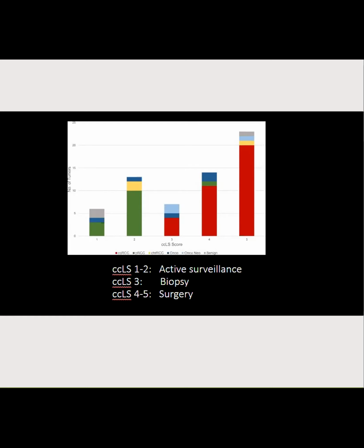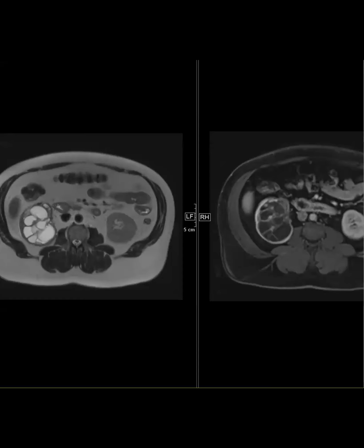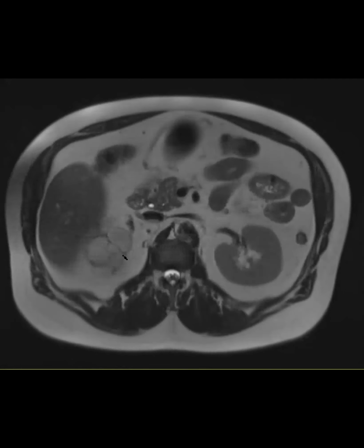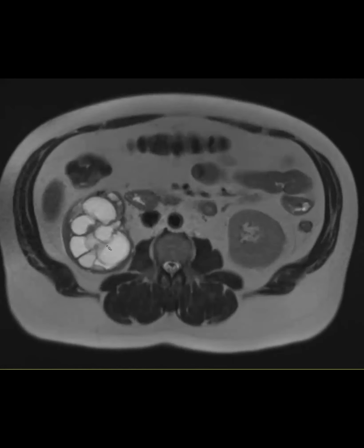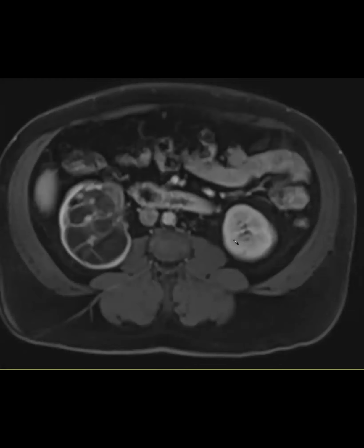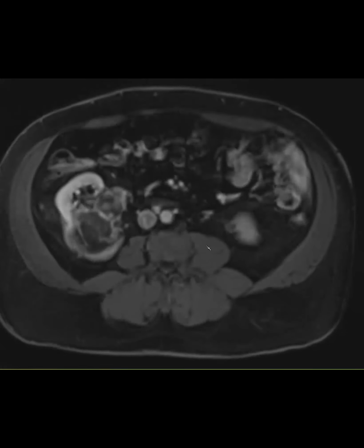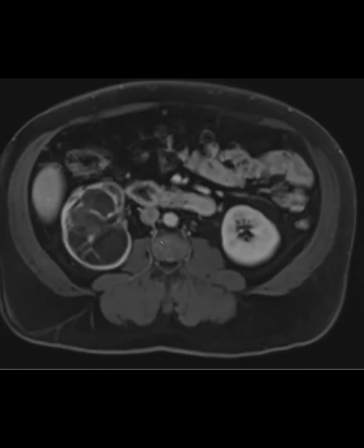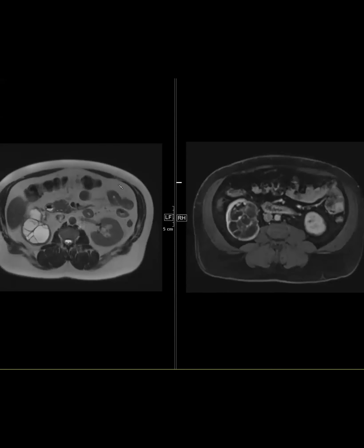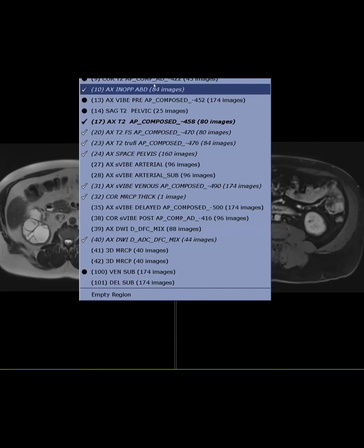I am now going to show you a cystic mass. Okay, so this is my cystic mass. I'll make it bigger. Or cystic lesion. Here's the post-contrast. Can you show it in coronal too? Yes. One thing on the post-contrast you might notice, there's some nodular septae. Yeah. And then I'll show you the coronal. Okay.